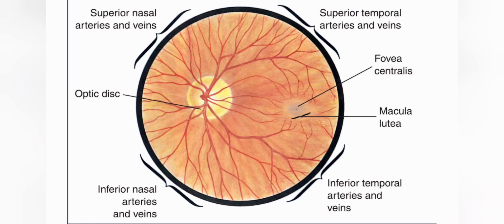And then lastly, we are going to darken the room again. Anyway, the two most important times that you're going to need to turn off the light during an eye exam include when you're doing the pupillary reaction to light, and then finally when we are doing the ophthalmoscope exam. We have the opportunity to take a look at the inner eye, and we're looking at very specific structures, the optic disc, making sure that the optic disc is slightly yellow/orange with demarcated edges. If there is anything that looks different, then we would talk to someone else or make a referral to an ophthalmologist. We are also looking at blood vessels, arteries and veins, and ruling out any pigmentation or bleeding.